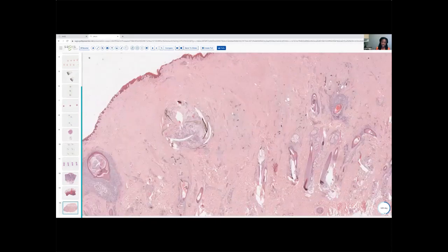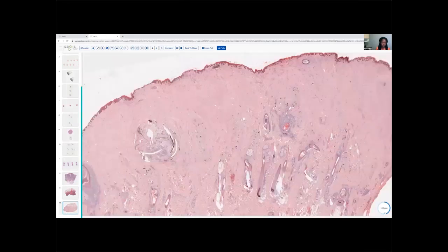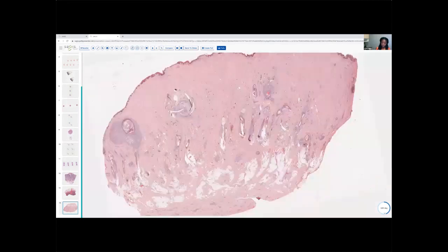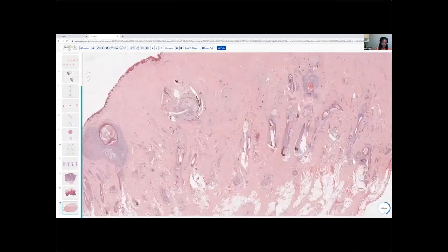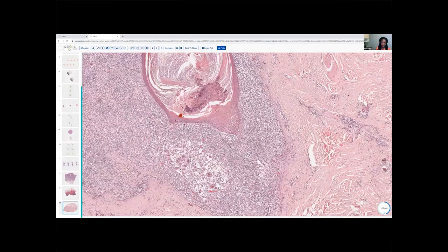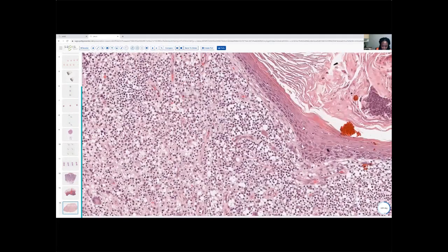We have this keloidal background, okay? And so both of those examples are acne keloidalis nuchae. And one thing I really should mention is that this cell type is going to be a little bit different. So we spoke about the fact that with folliculitis decalvans, the predominant cell type is those neutrophils that are involved in that pustular process. While here, when we take a look around, we have a good number of plasma cells, right? We have lymphocytes, but we also have a lot of plasma cells.